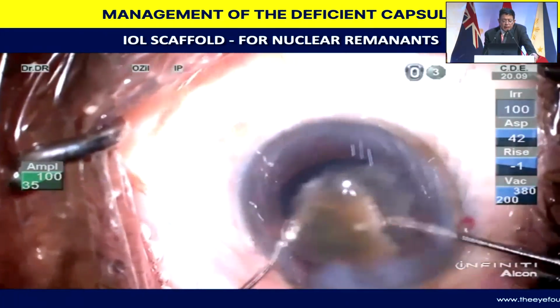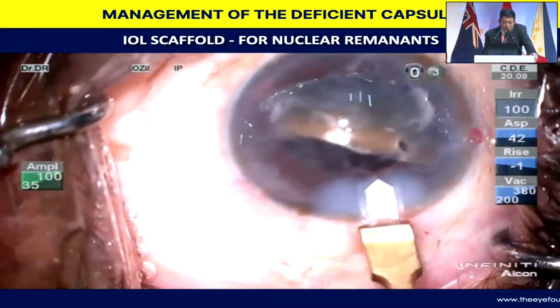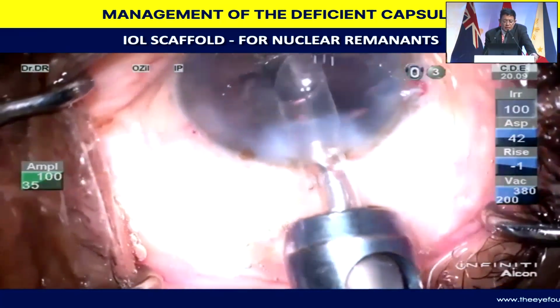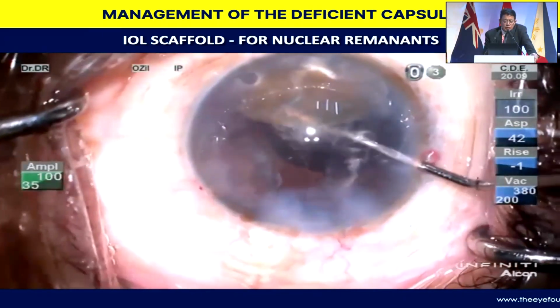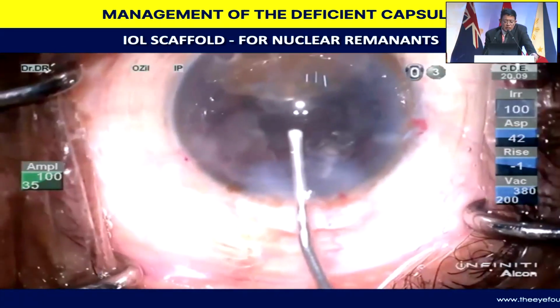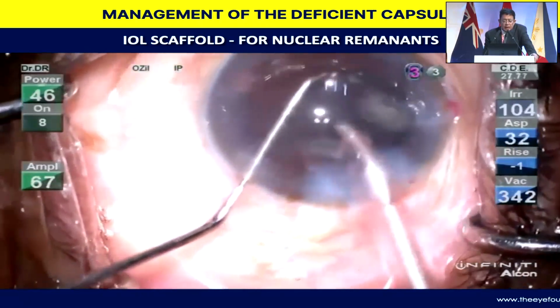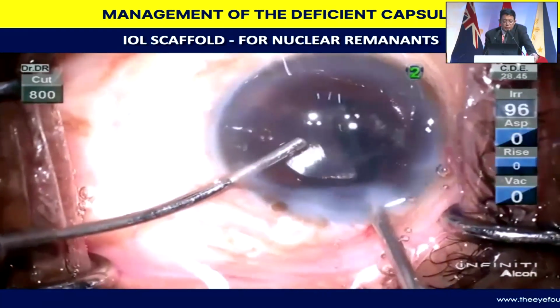Then subsequently, I know that the anterior vitreous face is not broken, and I inject dispersive viscoelastic, because initially the patient was to receive a single piece intraocular lens. It was a 2.4 millimeter incision. I enlarge it to 2.8 millimeters, and behind the large nucleus fragment, I introduce a 3-piece lens and place it in the sulcus. Once you have this in place, the propensity for the large nuclear fragment to fall back is significantly arrested, and with an adequate amount of viscoelastic, I go ahead and do an anterior chamber phacoemulsification.